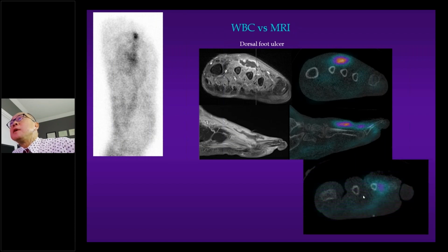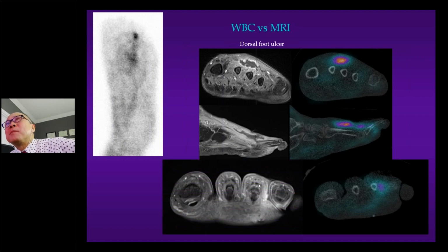And then I noticed this. We looked at each other and thought, oh, wait a minute, what's this? Did we miss something? So we quickly said thank you very much, went back to the department, and pulled out the MRI. Sure enough, it's not that the MRI didn't show this. We basically neglected it. So presumably that is infected as well. It just so happens that it's not yet abscess, it's phlegmon.